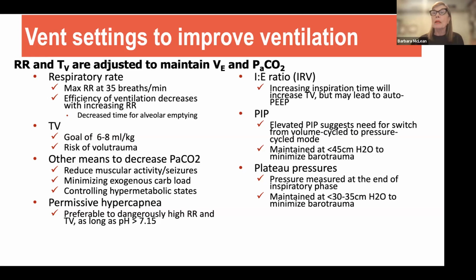So they're going to breathe much faster. But it is also really important for us to remember in standard ventilation, so that means assist control or SIMV with a set rate, either volume control or pressure control, anytime the rate is greater than about 30, what you start to see is a reduction in the time of exhalation, which means that you may actually trap gas in the lung, and that can promote something called auto PEEP. Now, sometimes we like auto PEEP. Sometimes we're trying to generate that, but it's important for you to know when you're trying to create that or when it is inappropriately created by your method of ventilation.